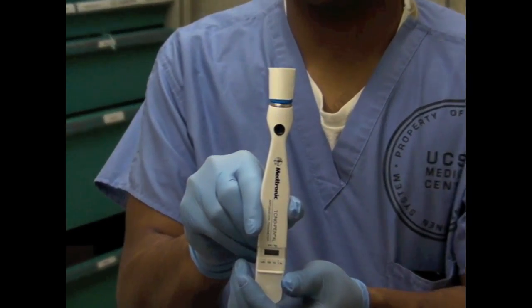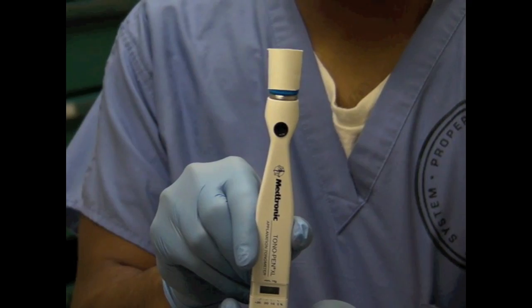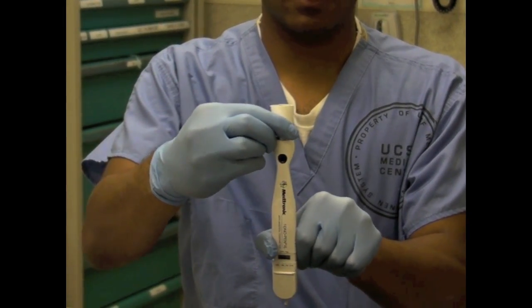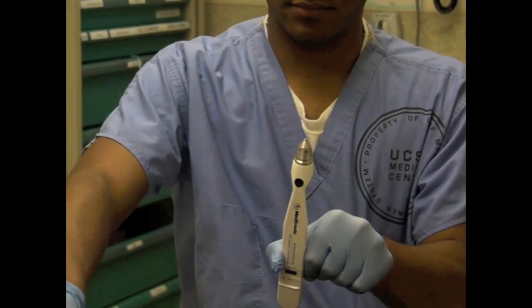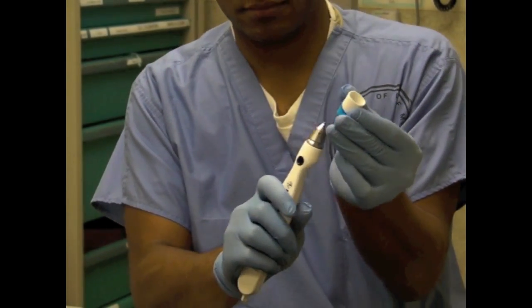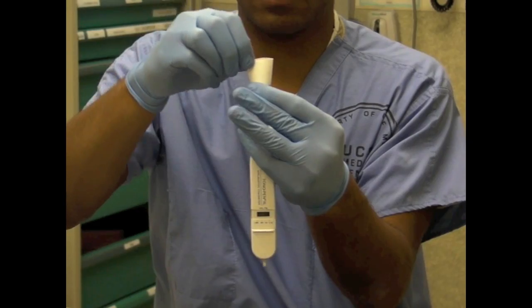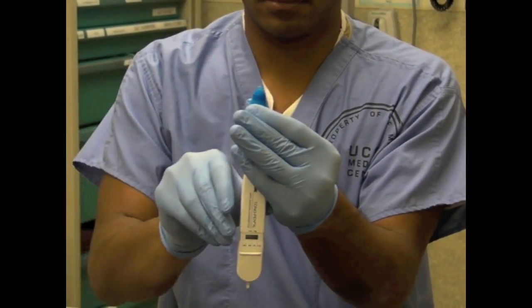After opening the case and taking out the tonometer, you may see a tip already in place. Assume that it is not sterile. First, remove the tip and open a new one. Place the new tip on the tonometer. Roll the bottom down and remove the paper attached to the tip.